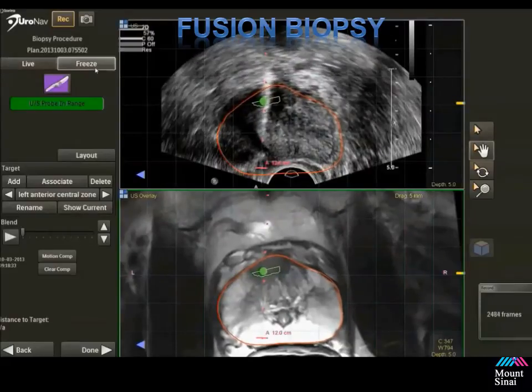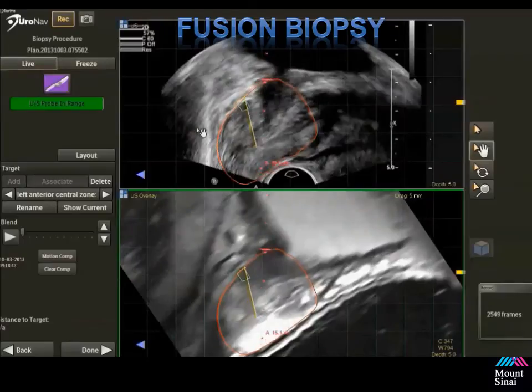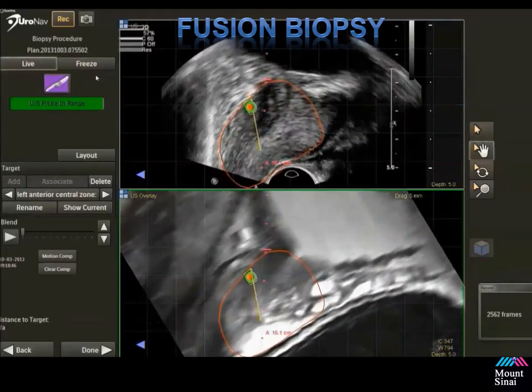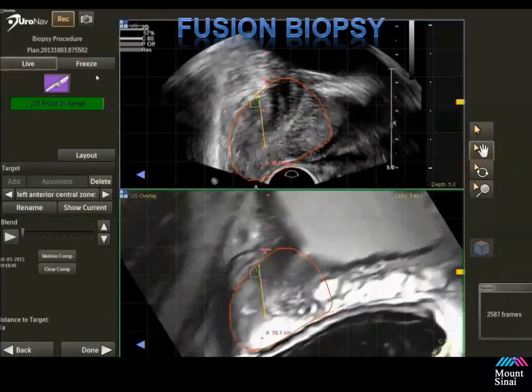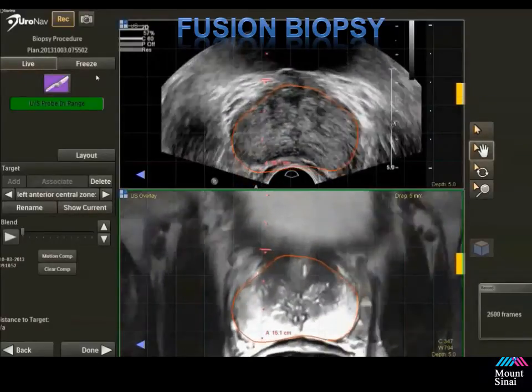This sampled the portion of the anterior of the prostate. Notice how this is almost 2 centimeters before the lesion starts. Therefore, most biopsy needles do not reach this point. We align, we mark where the lesion is, and then we perform this in the sagittal plane. Typically, I take 2 biopsies per lesion. Some people can take more when learning to make sure they optimize their sampling.